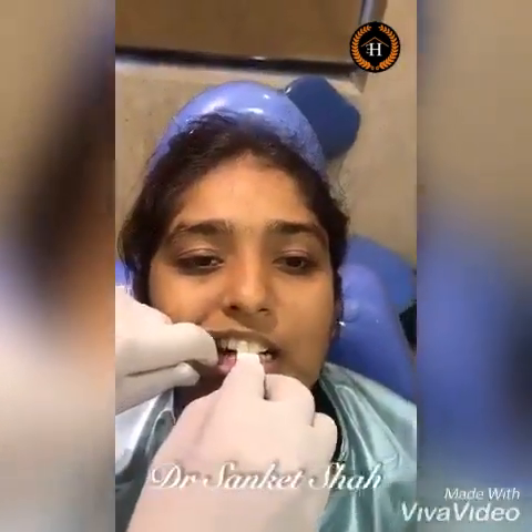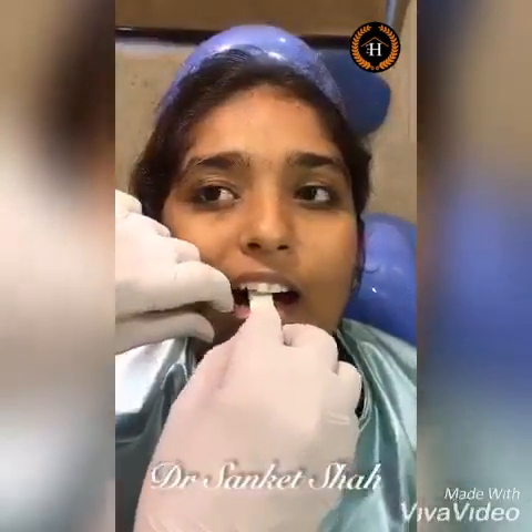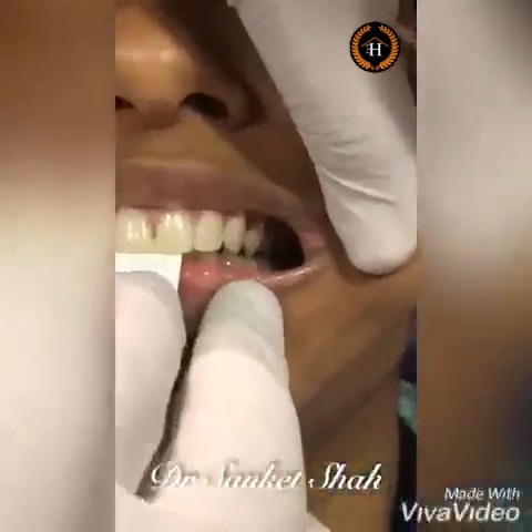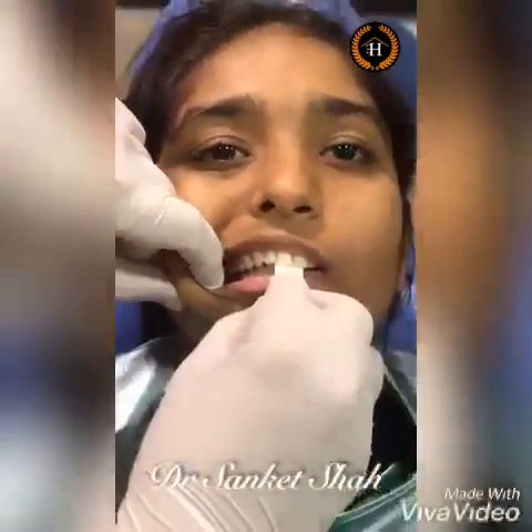I do not want that point to touch either — I want complete disclusion in my posteriors. So I take four more leaves. Bite from behind, forward, backward, squeeze. Are the teeth touching? No, they are not touching. This is my complete disclusion. When the patient does the forward and backward movement and then the squeezing movement, the mandible is loaded and seats into centric relation. We have a good amount of disclusion in the posteriors for our interocclusal recording material.